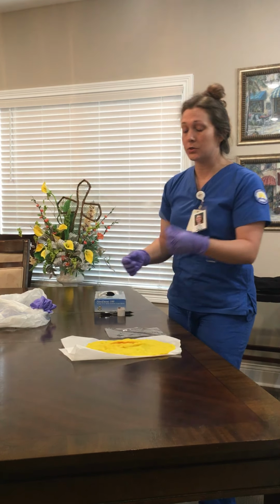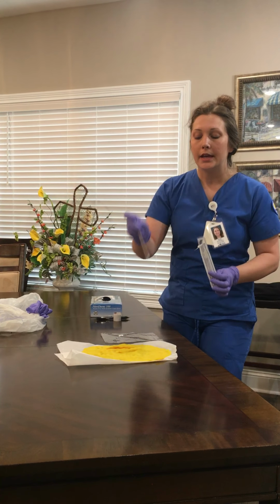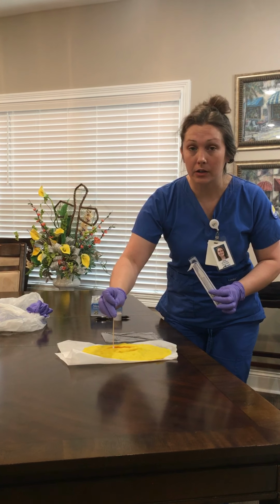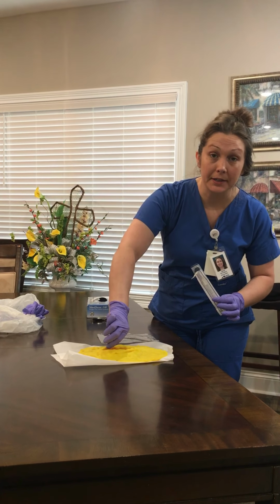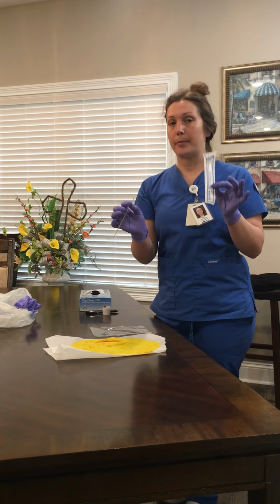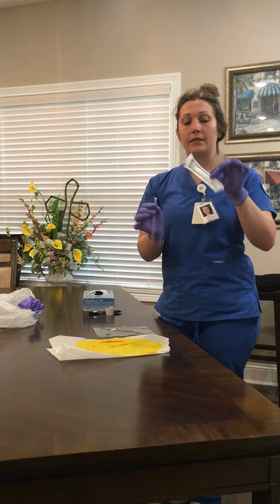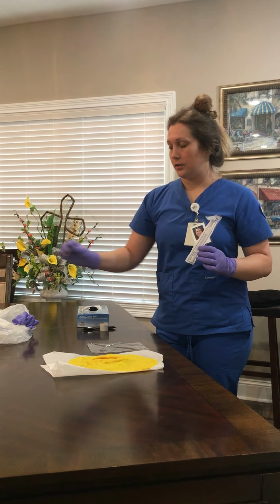and then for height or depth, this is when you're going to use your cotton tip applicators. You just take one out, and then you're going to feel around for the deepest part of the wound. Once you've found it, you can use your thumb to mark it, and usually the packaging that the cotton tip applicators come in has a little ruler on the side, so you can just use that to measure it. You can discard this one.